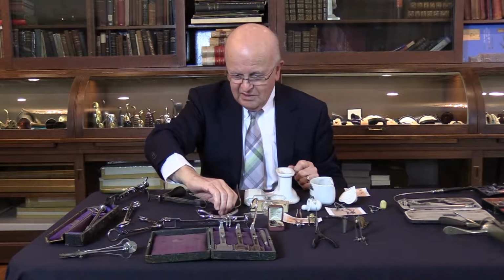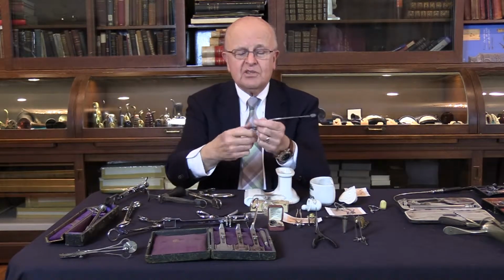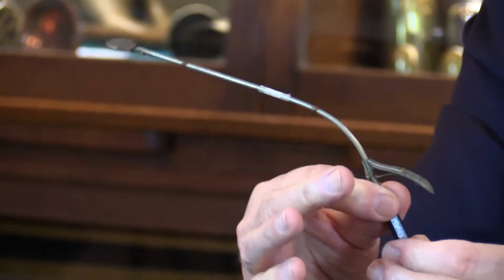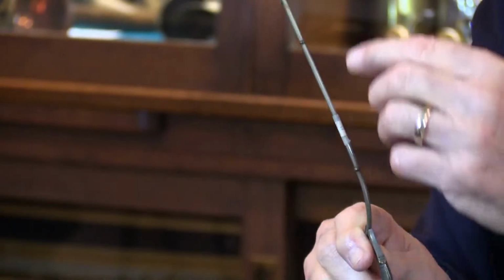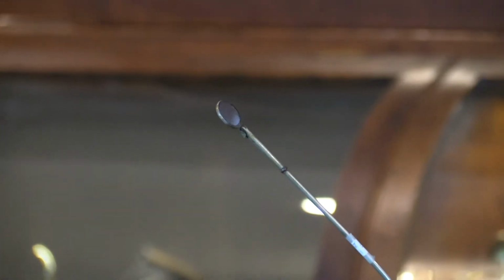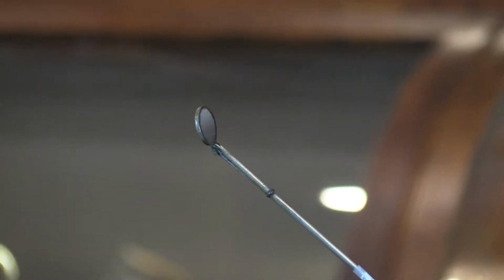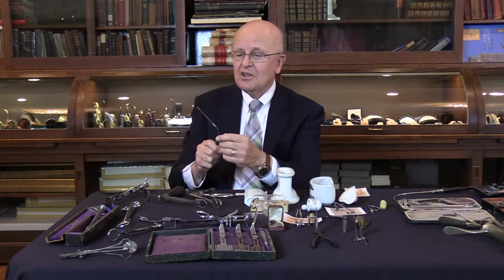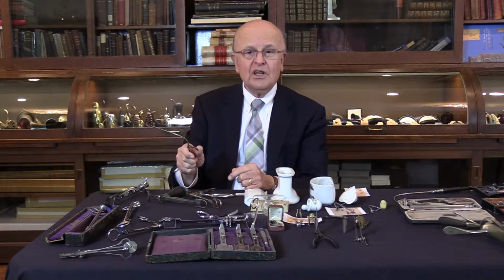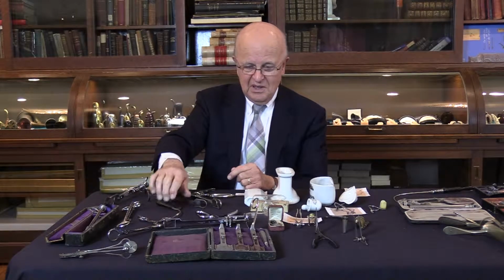The other thing that I want to share with you, which is very interesting, is the nasopharyngeal mirror. Again, it has an ebony handle, and here is the mirror. But the beauty of it is that it has this lever here, so when you move it, the mirror moves back and forth to get the exact line of vision that you can visualize the nasopharynx. Certainly this is before the fiber optic nasopharyngeal scope, but I thought this was very, very clever to do it this way.